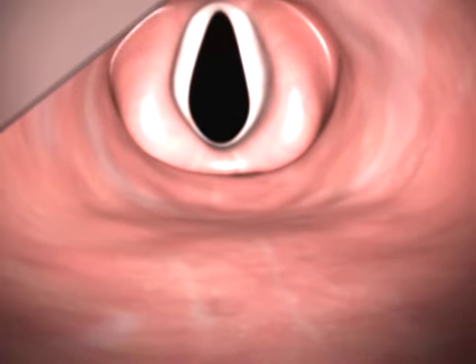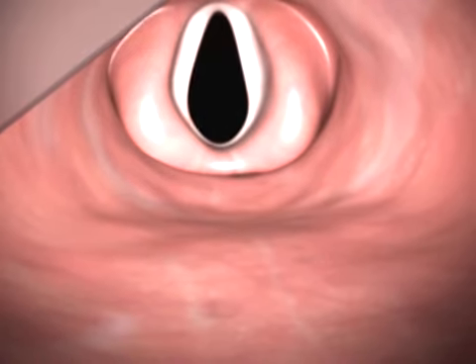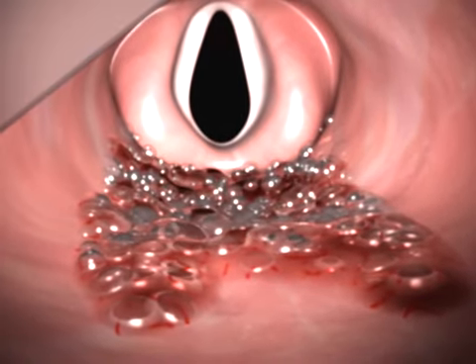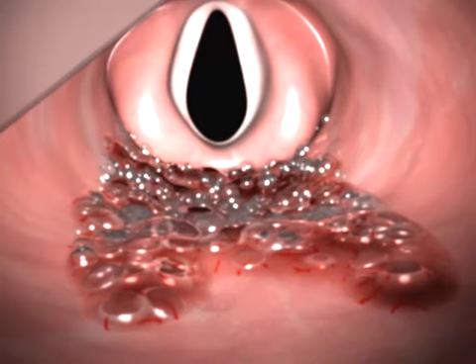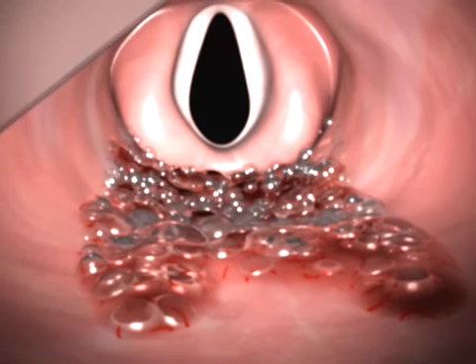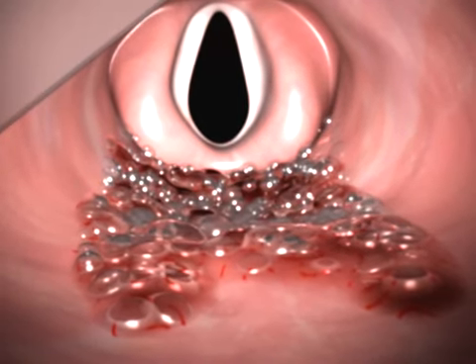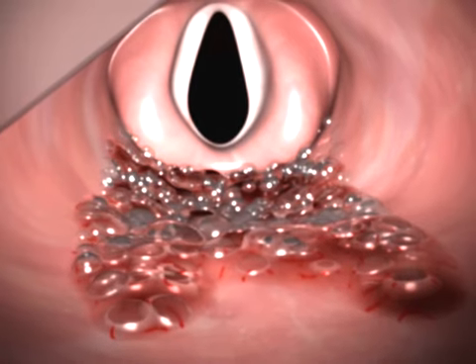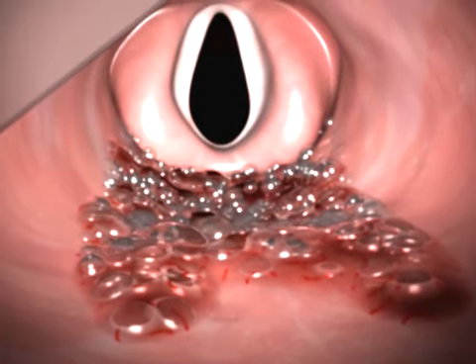This optimal view is achieved using minimal lift force, only 2 to 3 pounds. This provides a wider view and more working space for intubation, while the camera position further reduces the effect on the view from blood and secretions in the airway. The video image of the glottis when using the Glidescope Video Laryngoscope typically is a Cormack-Lehane Grade 1 or Grade 2 view.